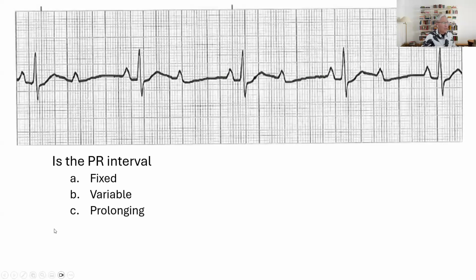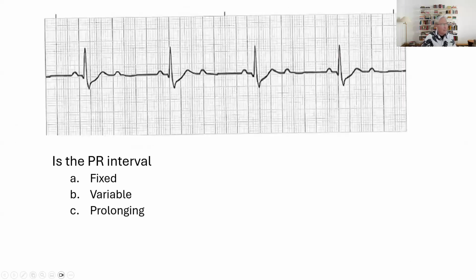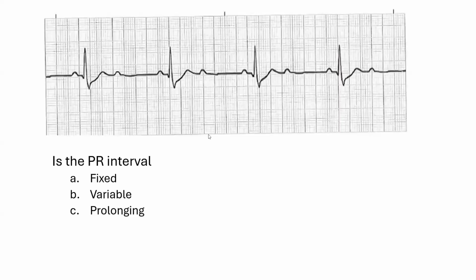We're going to look at this. Is there a problem? Yes, okay. So, prolonged PQRST, P, no partner. Not married. PQRST, P, no partner. No partner. We have an AV block. Okay, over here. Yeah, also no partner. See these P waves right over here? They do not have partners. So we have an AV block.